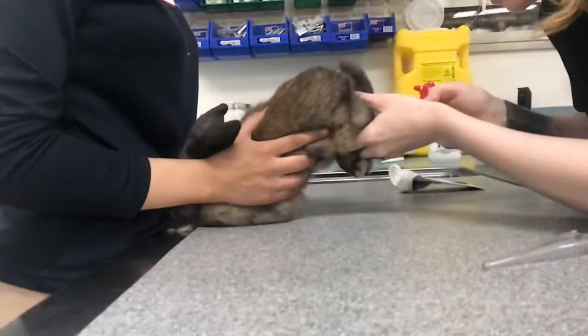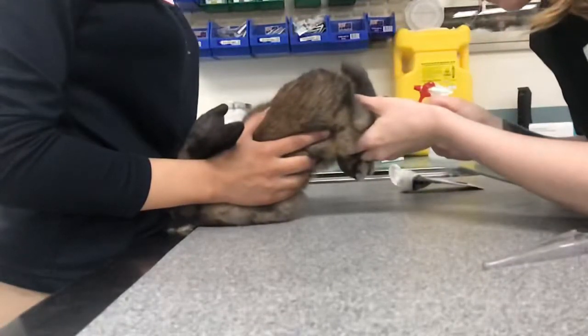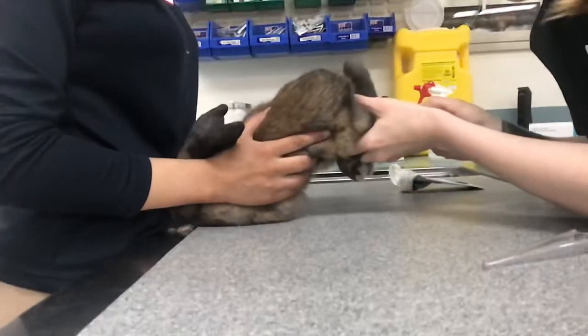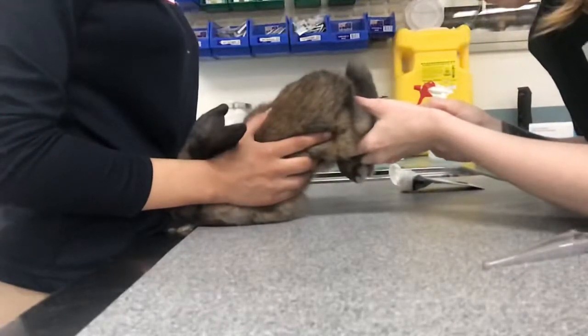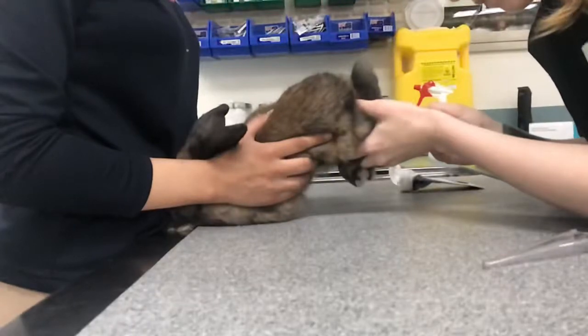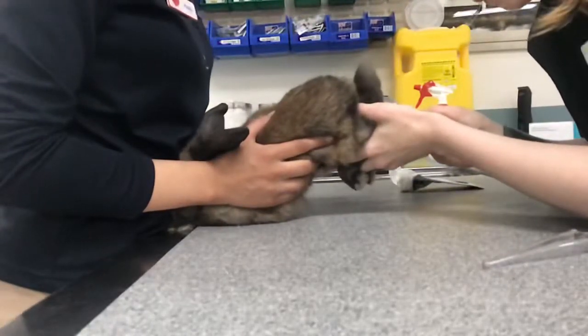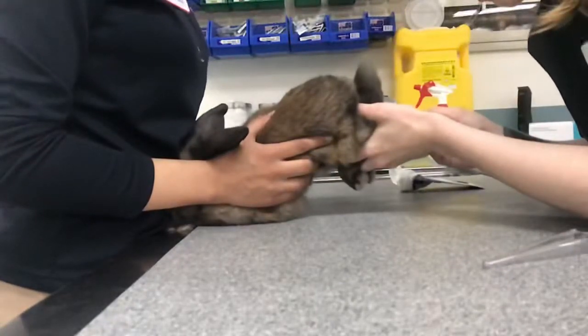Well, she's doing very well. Yeah, she's very calm. Very calm. Oh, there we go. And then wait for it to start beeping. Quite high. It's probably just stress though. Mm.